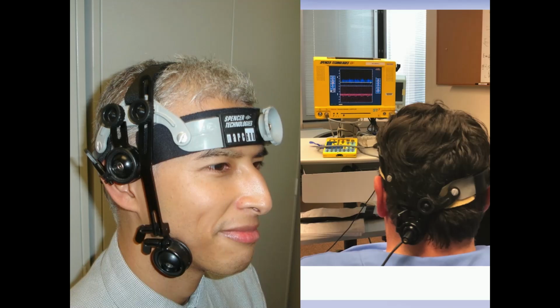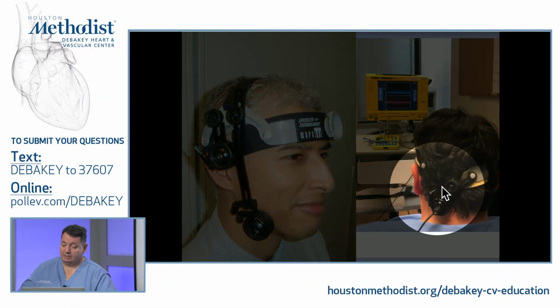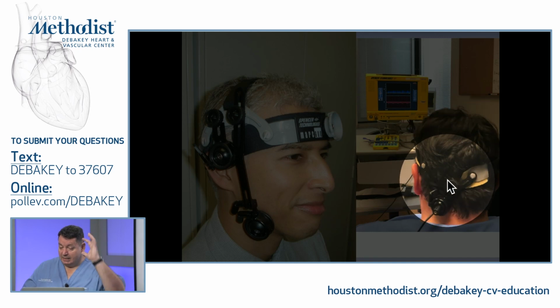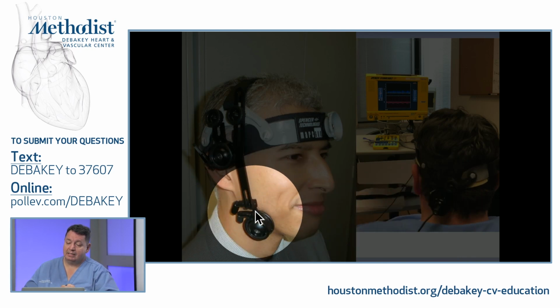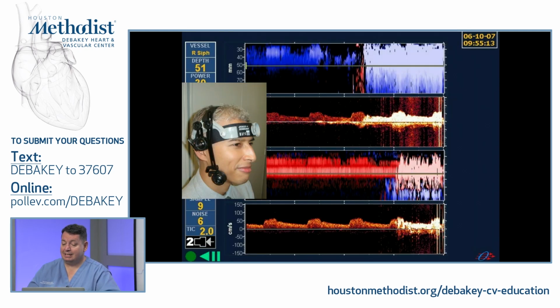Again, some patients don't have temporal bone windows. Then we came up with this great idea, with some Italian colleagues, already published, that I'm practicing on my own neck: a vertebral window. The head frame is upside down and I'm monitoring my vertebral artery. Here you can monitor the submandibular ICA, or my friend Branko in Zagreb is doing it with just the duplex. The duplex alone is able to show you the terminal ICA, and that's the same feeling that you're going to see. The ICA is going to show your bubbles.